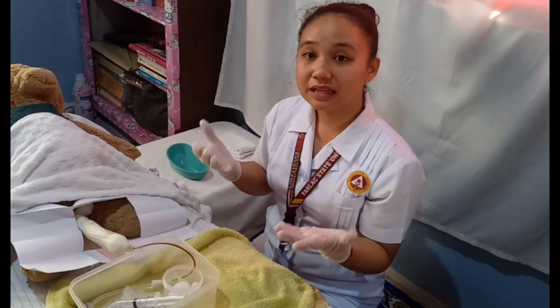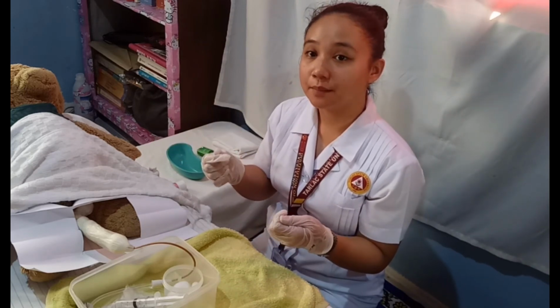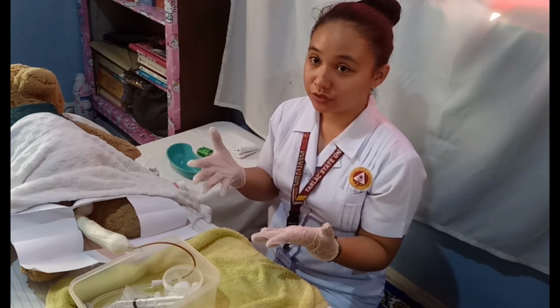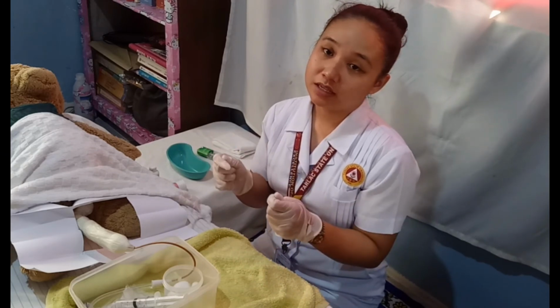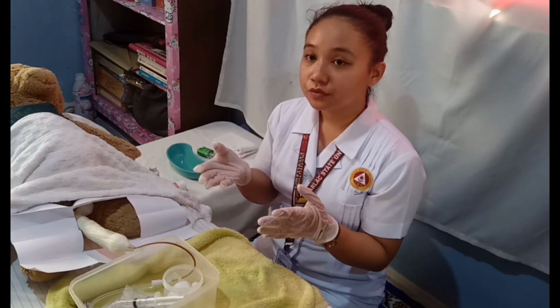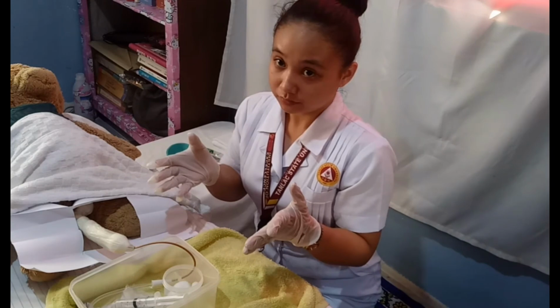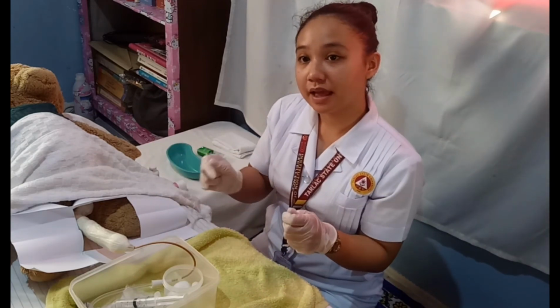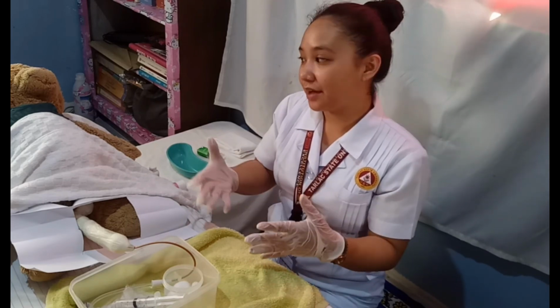And then for both male and female, if the catheter is to be indwelling, you need to inflate the balloon according to the manufacturer's recommendation, for about 5 ml, and then pull gently on the catheter after the balloon is inflated to feel the resistance. Then secure it to the upper thigh with a velcro strap or tape, and leave some slack in the catheter to allow for leg movement.